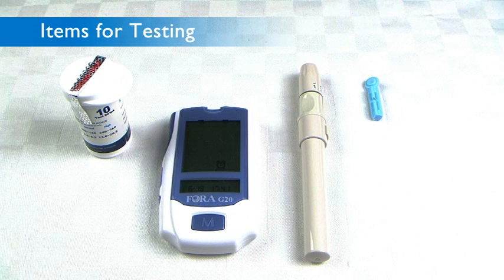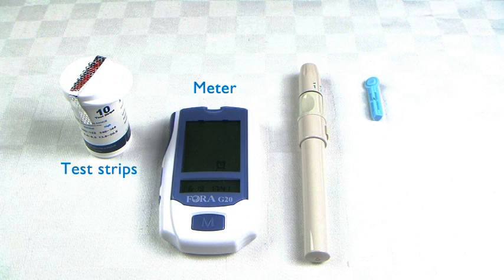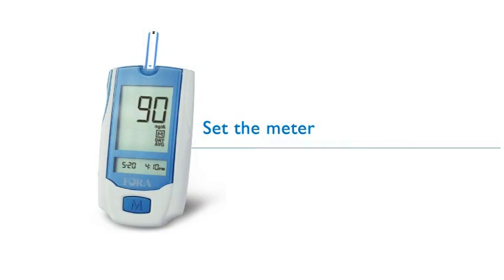Items for testing: Meter, Test Strips, Lancets, Lancing Device.